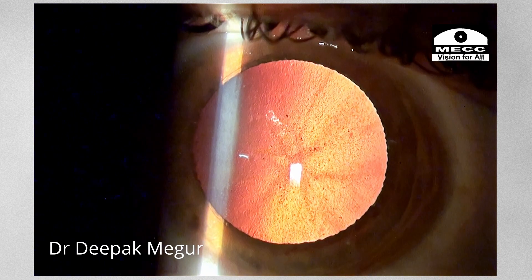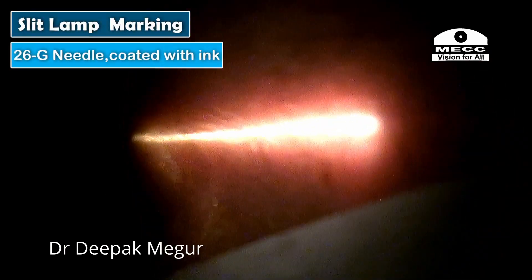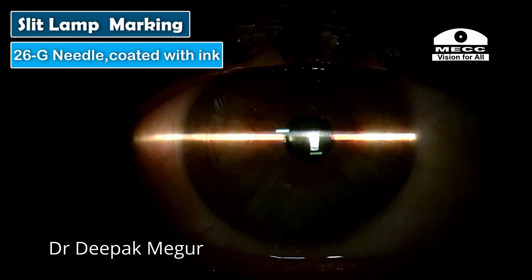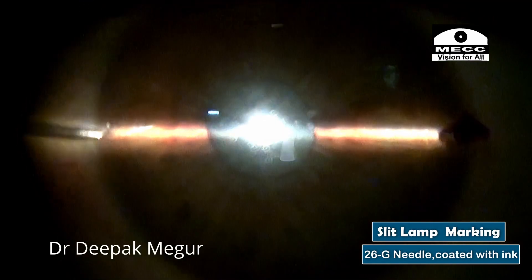So my plan is to do an incision on the steep axis and hope for some more correction. The slit lamp marking is being done with a 26-gauge needle coated with ink. Care is taken to rule out any abnormal head tilt. The needle is used to puncture up to the anterior stroma on both ends of the reference marks at 0 and 180 degrees.